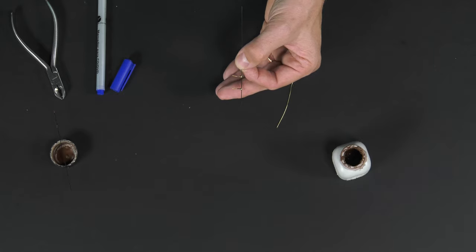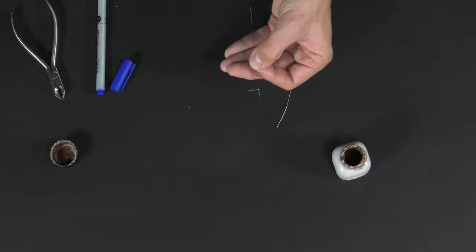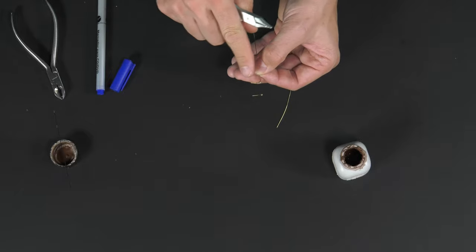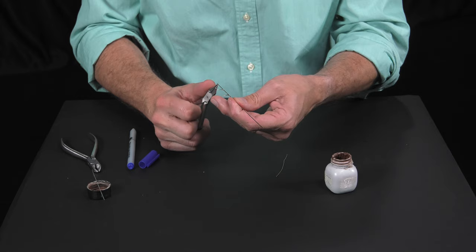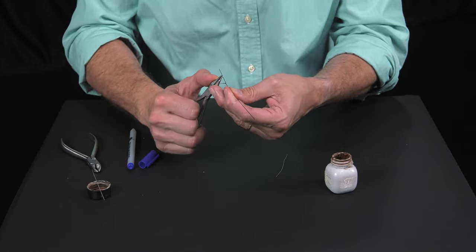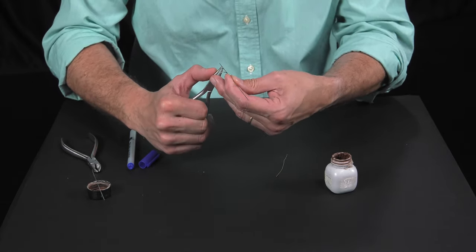The hooks are now soldered to the base wire and we can shape them with, for example, an angle plier or tweed plier to form omegas, and then cut them.